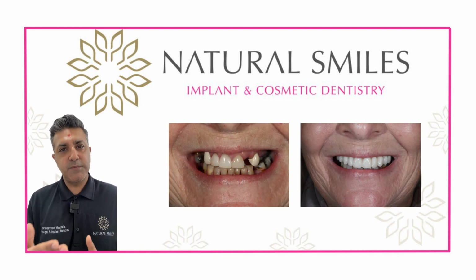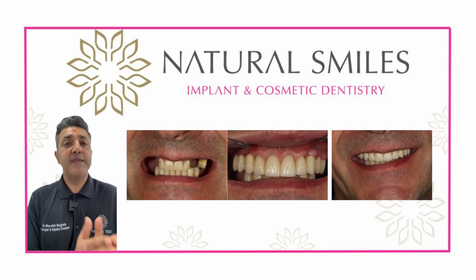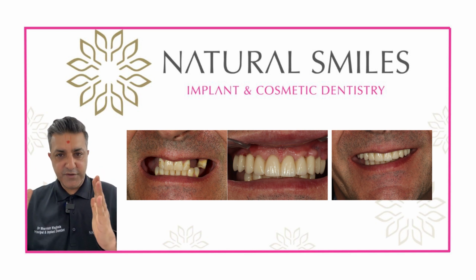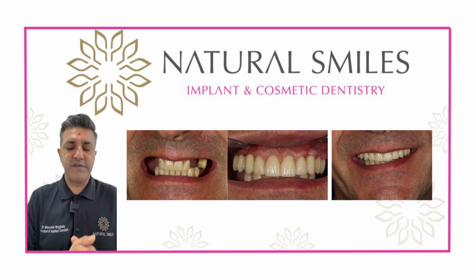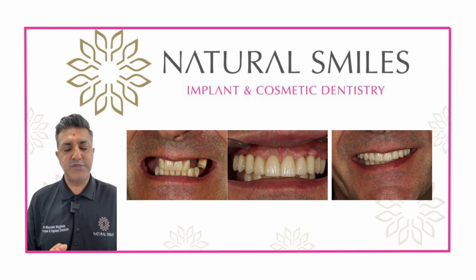And we would treat patients on a case-by-case basis. So we would say to patients, look, you are in a position where you can have this FP1 bridge with minimal artificial gum, and you can have the other one as well, and it would be your decision or your choice as a patient to make a decision in which you'd like to choose.